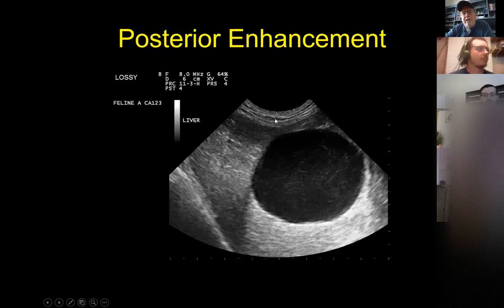Well, half my football team is over here, and they're running through, and every time they hit a cell wall, or the edge of the liver, or the edge of a vessel inside the liver, they are expending energy to fight through all the stuff that's in the way, right? On the other hand, the other half of my team comes down this way, and everybody's at an equal part right in here until these lucky guys come down the field and they have it home free. There is nothing in the way, because we have this anechoic, fluid-filled cyst with nothing in it.